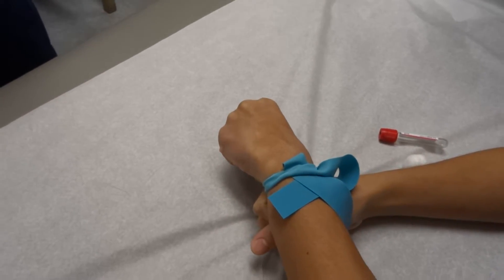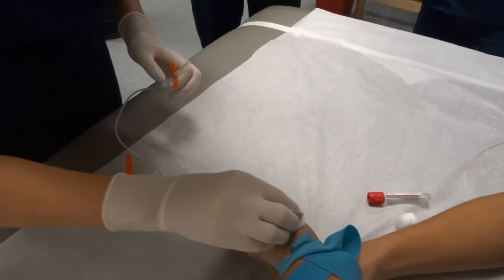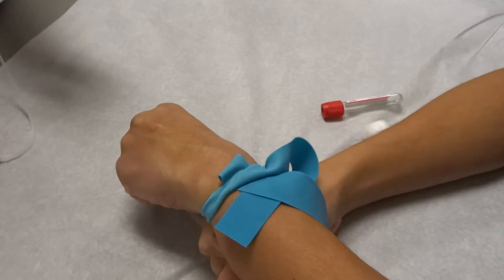You can't be too gentle with those — the rougher you are, the more they come up easily. They're usually just real thin and skinny. So anchoring is critical, because if it rolls just a hair, you can lose it. Yeah, it looks like it might roll too.